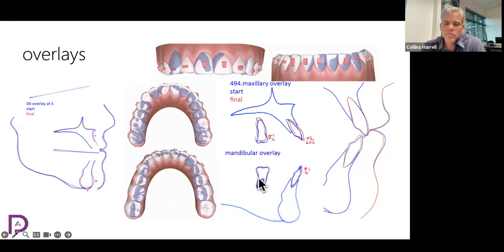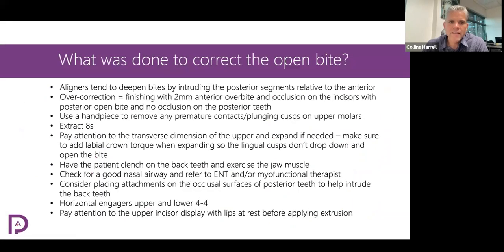And in the lower arch, the molar stayed where it started and the lower incisor came forward just a tiny bit because there was that little tiny bit of crowding. And also we had class 2 elastics in the mouth. And there was very slight extrusion of that lower incisor. So even though I didn't see anything in the setup that necessarily was extruding those upper and lower incisors, the overlay does show that there was some extrusion that happened, but her bite finished very nice.